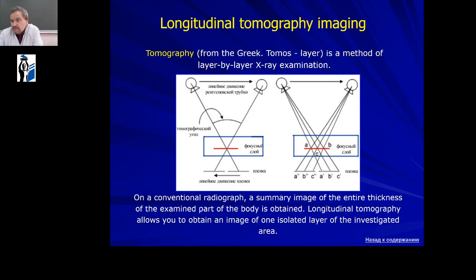Next, the next method of X-ray examination is longitudinal tomography imaging, or linear tomography. Tomography, from the Greek tomos, layer, is a method of layer by layer X-ray examination.